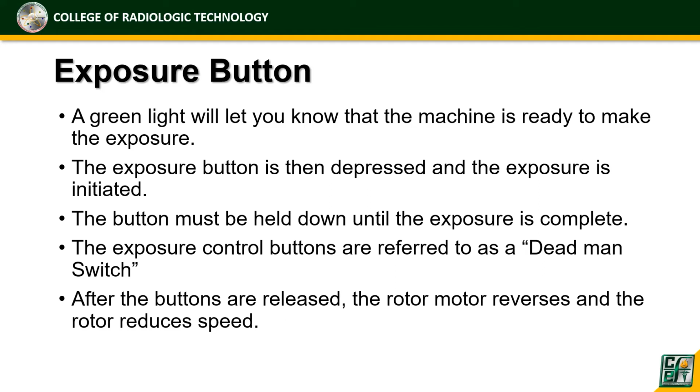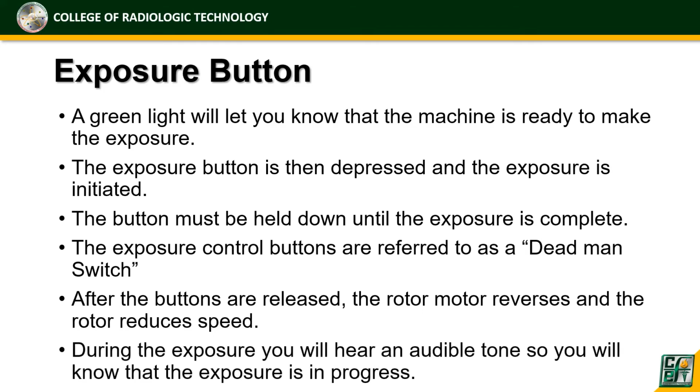After the buttons are released, the rotor motor reverses and the rotor reduces the speed from 3,400 revolutions per minute.